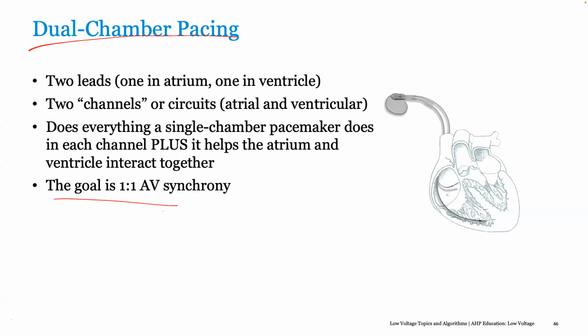When we programmed, we noticed that if we program the base heart rate at 60, we are not getting enough. I remember AJ was the one that did that programming because we used St. Jude that day. So we had to move the base rate to around either 85 or 90, if I'm correct, AJ. Yes, before we were able to get a significant response.